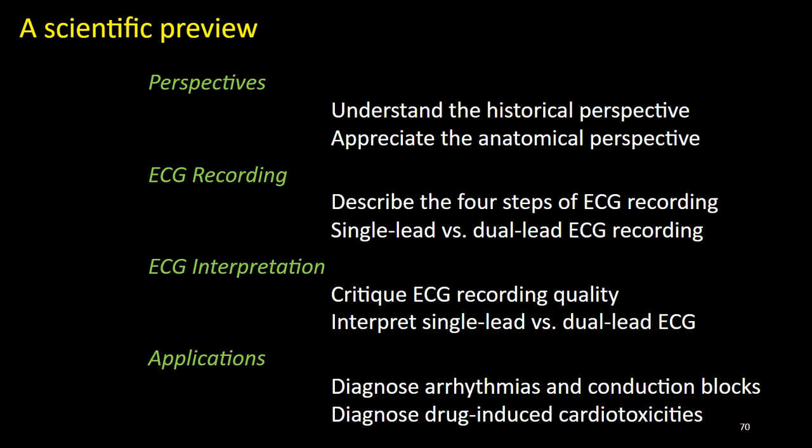blocks. Importantly, we shared with you unpublished dual-lead ECG data of the first zebrafish Einthoven's triangle. Using dual-lead ECG, we defined the 3 frontal heart electrical axes of zebrafish in quadrant 4, which are reflections of the 3 human heart axes in quadrant 1. We also showed how zebrafish Einthoven's triangle remarkably recapitulates the hallmark human digitalis effect faithfully along the heart short axis, but in mirror image along the heart long axis.